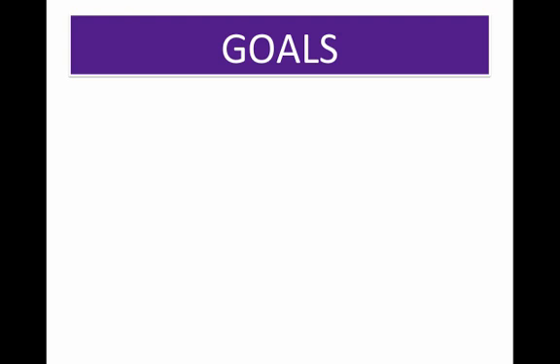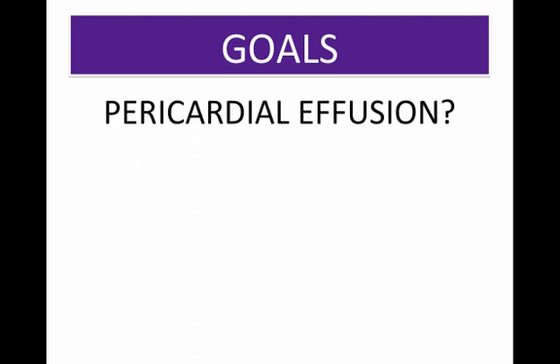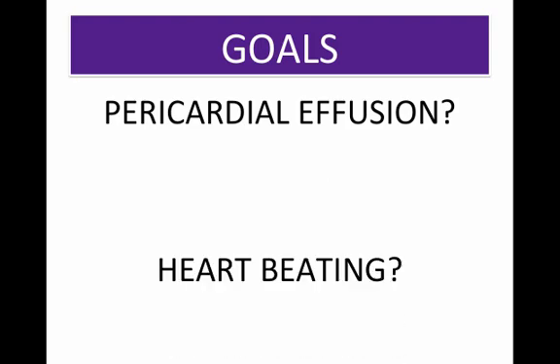In more advanced modules, you will learn to generate additional views of the heart in different planes. You will also learn to evaluate and grade contractile activity. However, for this module, we will restrict your focus to two fundamental questions. Number one, does this patient have a pericardial effusion? And number two, does this patient have a heart which is beating?